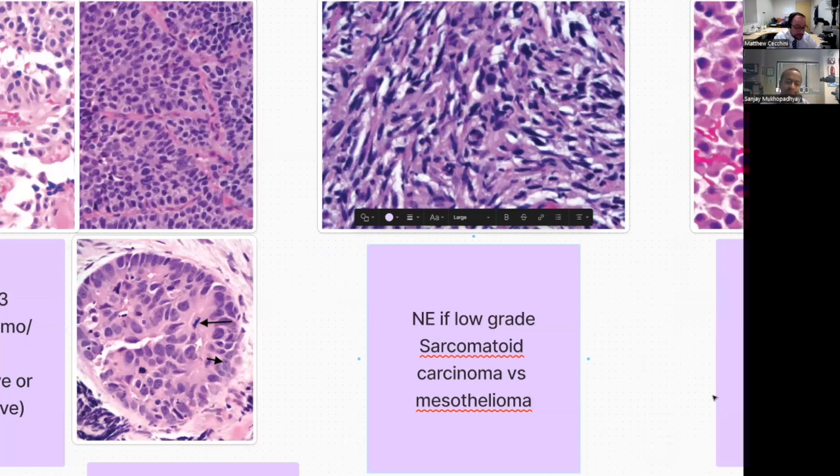And I often will diagnose things as malignant sarcomatoid neoplasm, see comment. Me too. And sometimes I say, look, I don't know if this is carcinoma, meso, or sarcoma. I think that is very reasonable, especially on a small biopsy, as long as you're doing your best to try and solve it, but sometimes you can't. Totally agree. Same with me, Matt. Great. Okay, so this has been good.